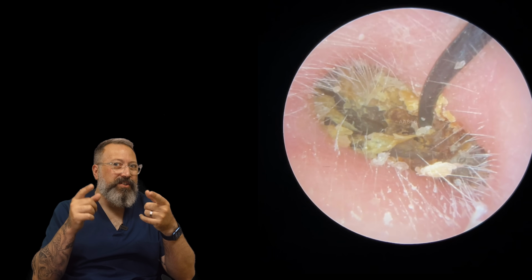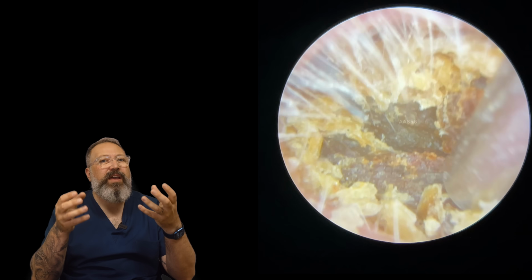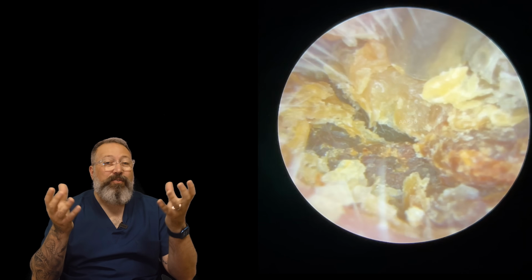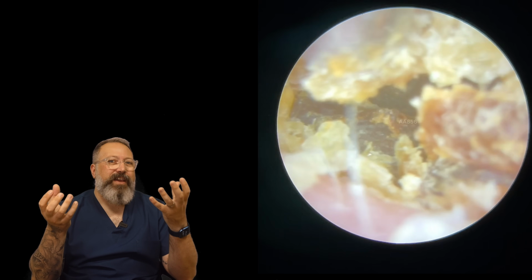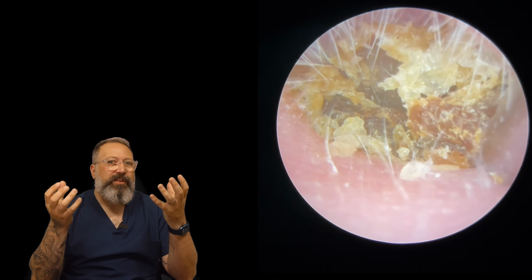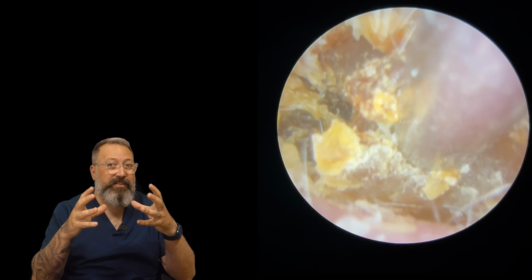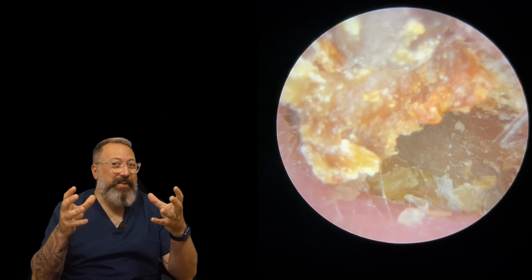See how the Rosen inserter is just cutting straight through it, which means that it's a very, very thick clay consistency wrapped in a shell or a husk of dry keratin. So yeah, not an easy one to remove. So basically the clay type wax is going to be anchored onto the keratin. The keratin is going to be dried onto the canal, which means nothing wants to come out of this ear canal.